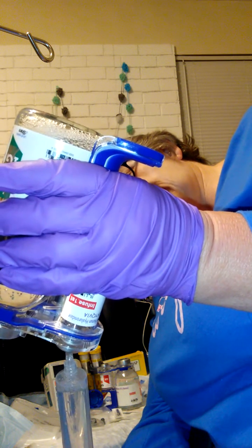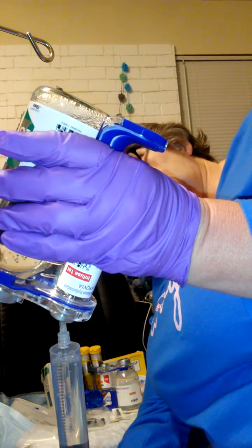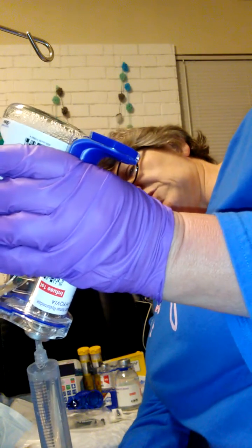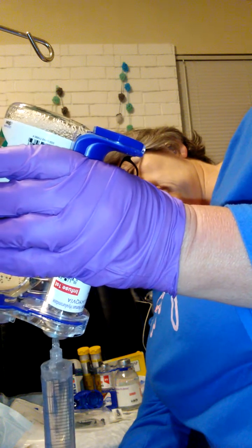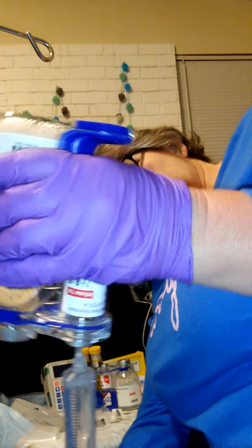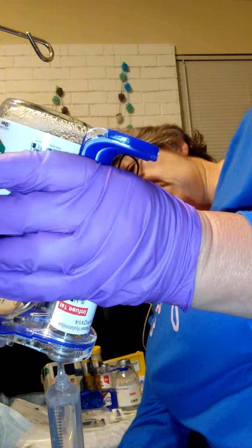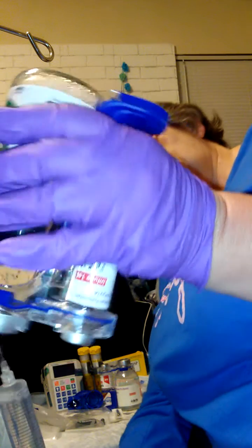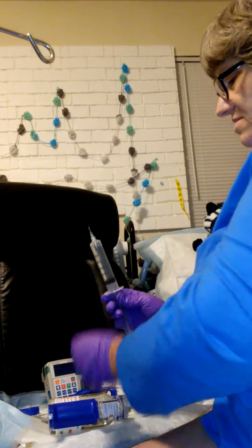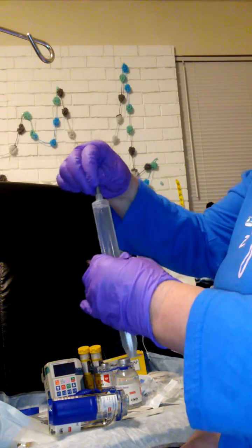Got a few more bubbles coming. Be careful as you pull down. You don't want to totally lose all of that that's in your syringe. So always be cautious how you are pulling that down. You don't want to go to the bottom here. Just get all that you can. And be really careful at the end here as you're pulling this off, because you may get a splash back. There we go. It's all out, guys. You just take this and lay it down right there. I'm going to put this lid right back over that.